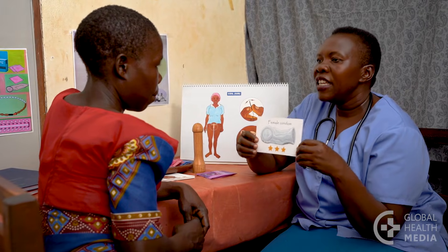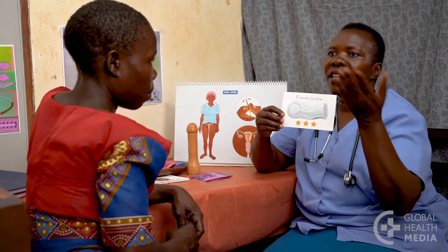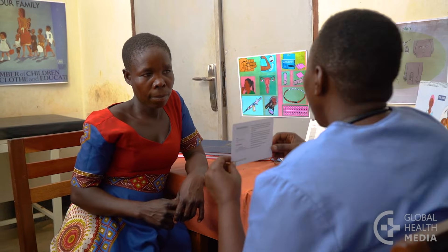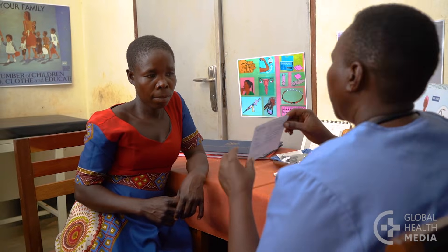The female condom gives women a lot of control to protect themselves, and some men like them better than male condoms. Here's how to use one.